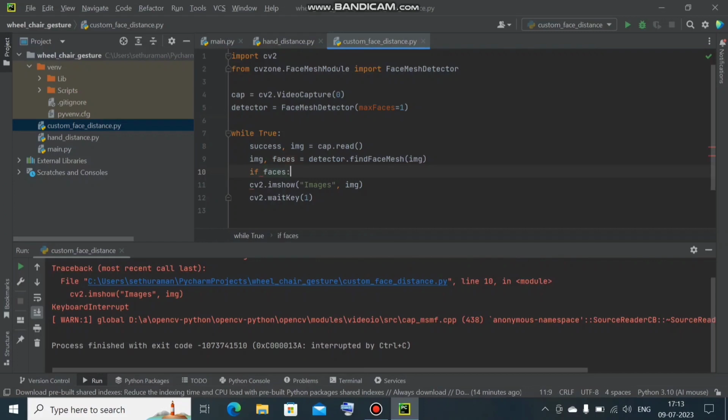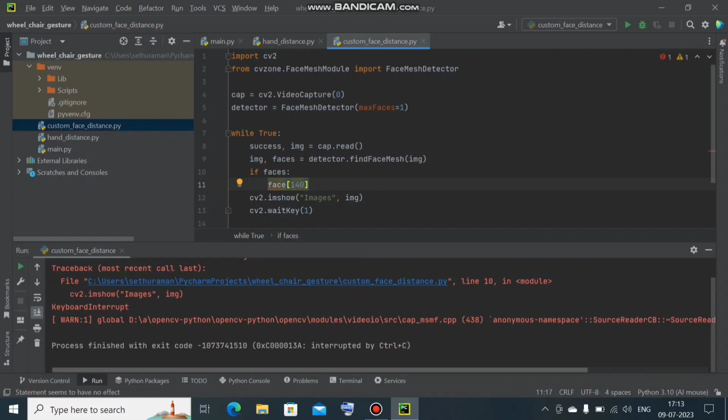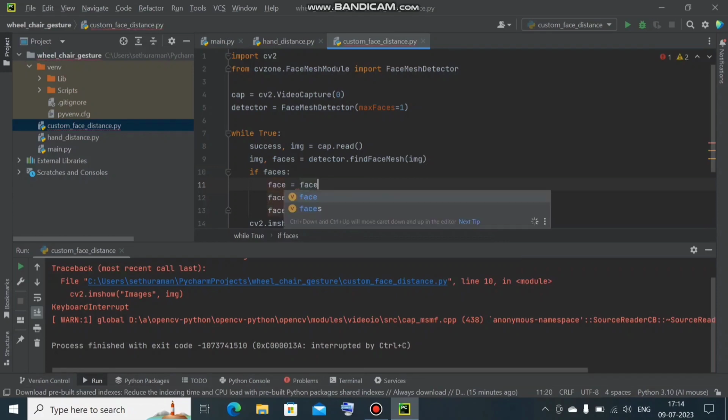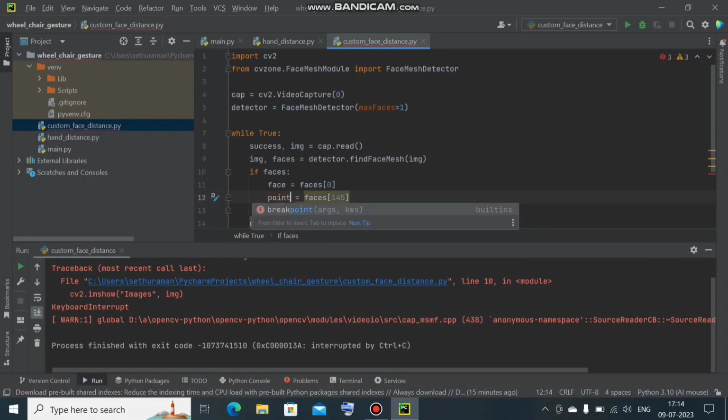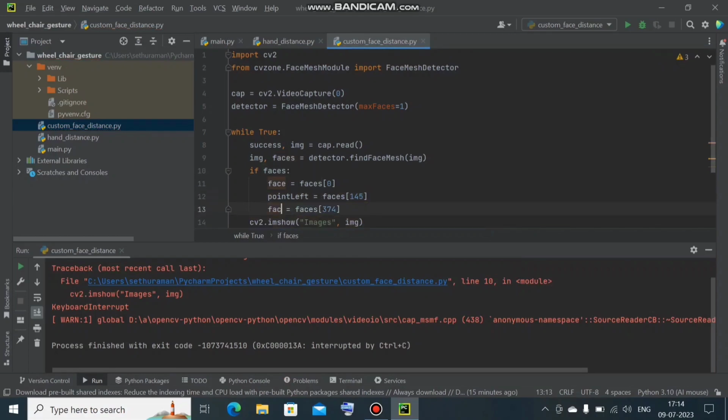If faces: face of the index point. The index point is 145, and face of 374. We will assign the variable face. Instead, we can do it like this: face is equal to faces of 0. The zeroth element means the first element. If we put 1 there instead, it will be the second element. So 145 is the left point of the eye, and 374 is the point on the right side of the eye.